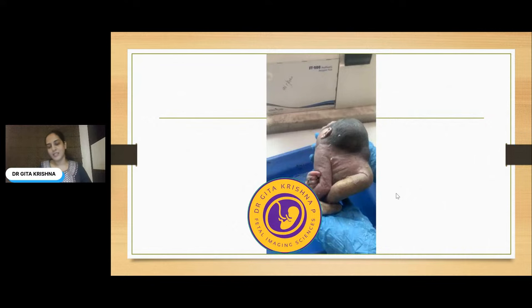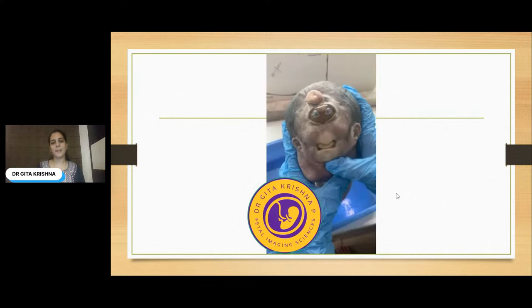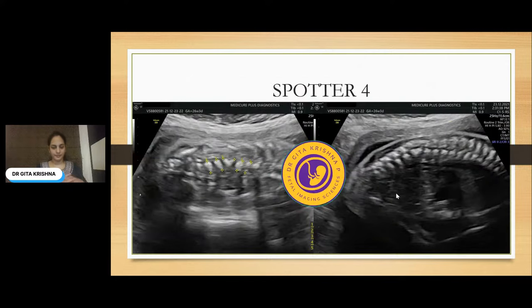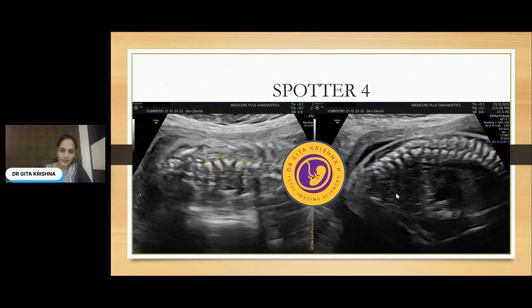We will switch to the next spotter. These are the sagittal as well as coronal images of the spine. What is your diagnosis here?